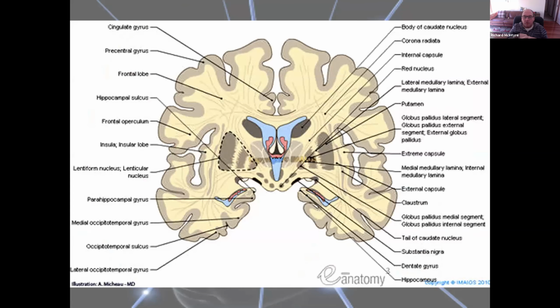Now we've got a coronal image. Okay, so we'll go through all those structures, but one thing this coronal image shows us really well is the temporal lobes. Again, we've got these nerve tracts. Okay, we've got what's called the corpus callosum, so the nervous tracts pass from side to side. We've got the different structures there that we'll cover throughout the talk.